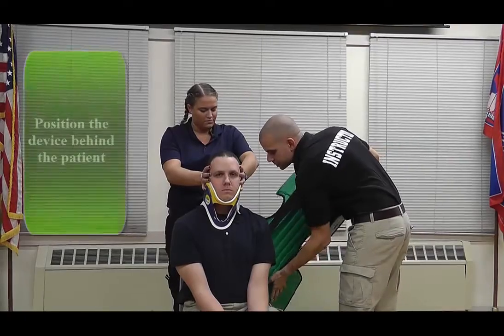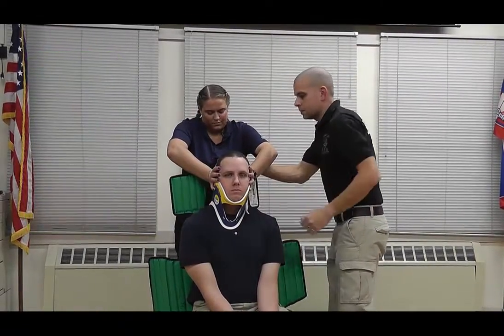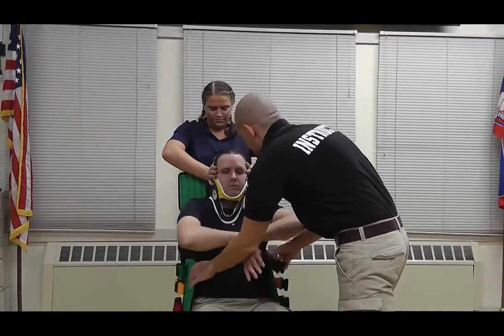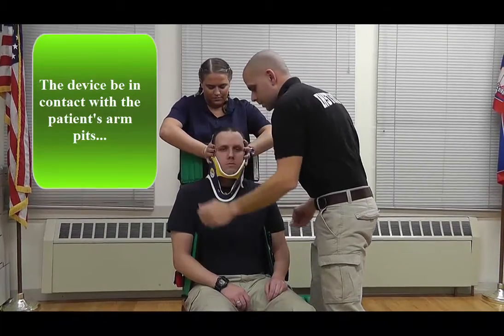Slide the device in. And now I'm going to rotate the device upward. Sir, bring your arms up. Now I'm going to make sure that the device is placed at the appropriate level. I'm going to gently lift it and watch the shoulders shrug. Excellent.